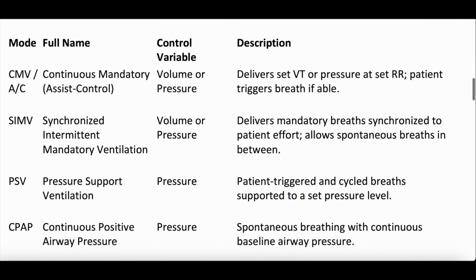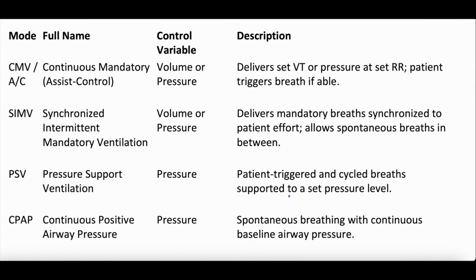All right, what about common ventilator modes? So here we'll break it up into mode, name, controlled variable, and description.